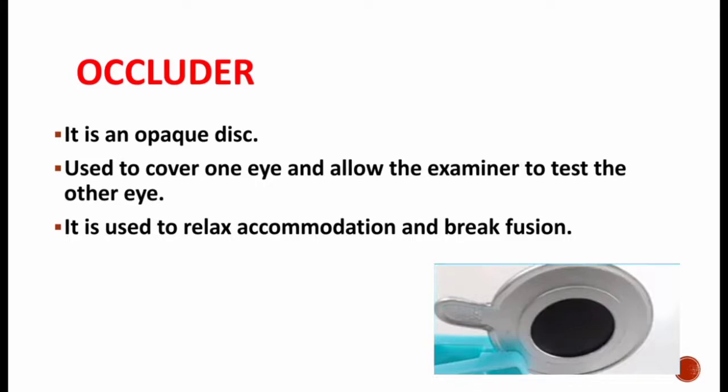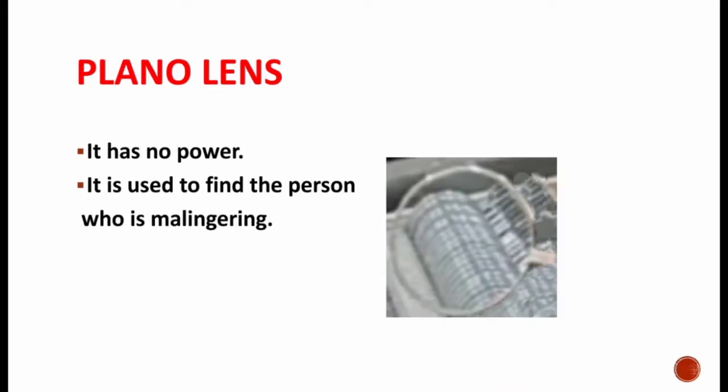The image displayed in this slide is the image of the occluder. Next, plano lens.